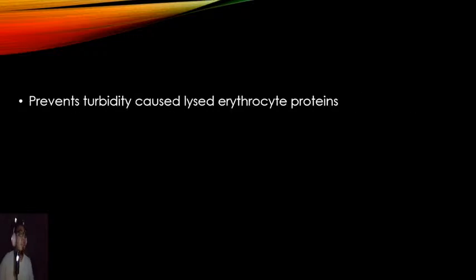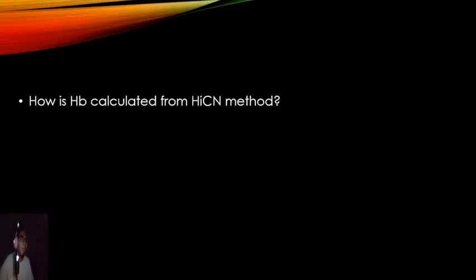Okay, now how is it calculated? How is hemoglobin calculated using the HiCN method? Well, we use absorbance, of course.